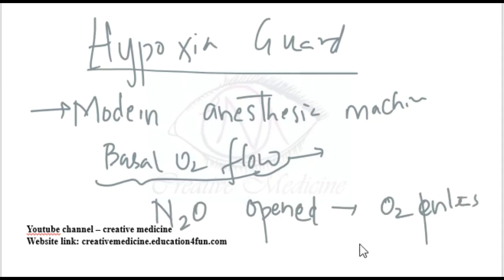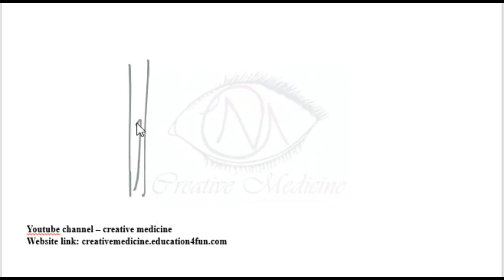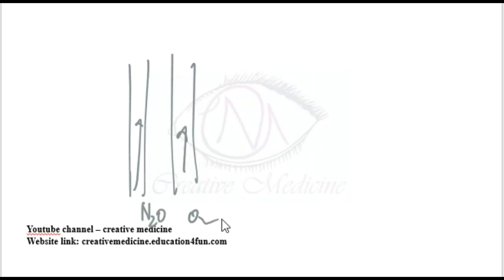So if you open nitrous oxide at 3:1, automatically oxygen will also get opened in a fixed proportion. That is called a hypoxia guard. So that is the reason why in hypoxia guard we have nitrous oxide and oxygen. This is actually a rotameter itself, but here once you open the nitrous oxide, the oxygen will also be delivered to the patient in a fixed proportion.